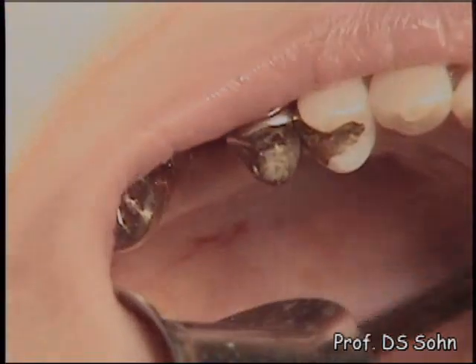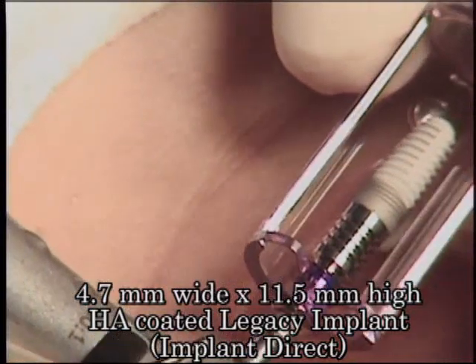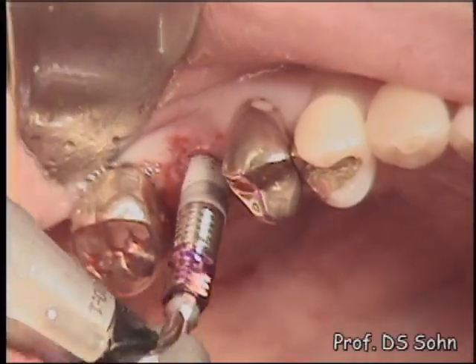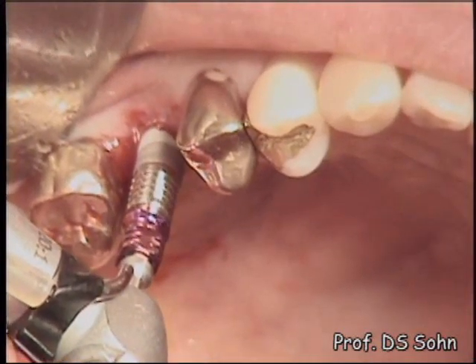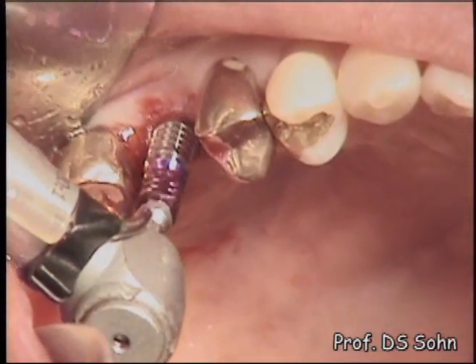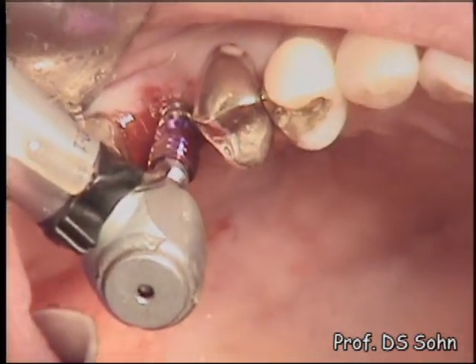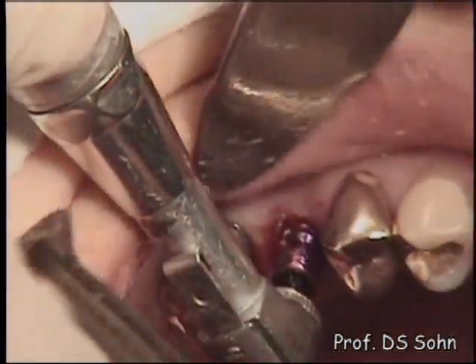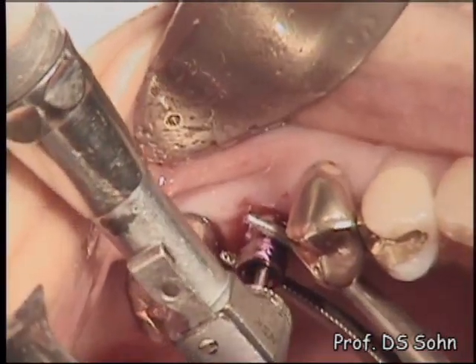A 4.7mm wide, 11.5mm high HA-coated implant was inserted, but the initial stability was not good due to poor bone density, even though an undersized osteotomy was performed. So this implant was removed.